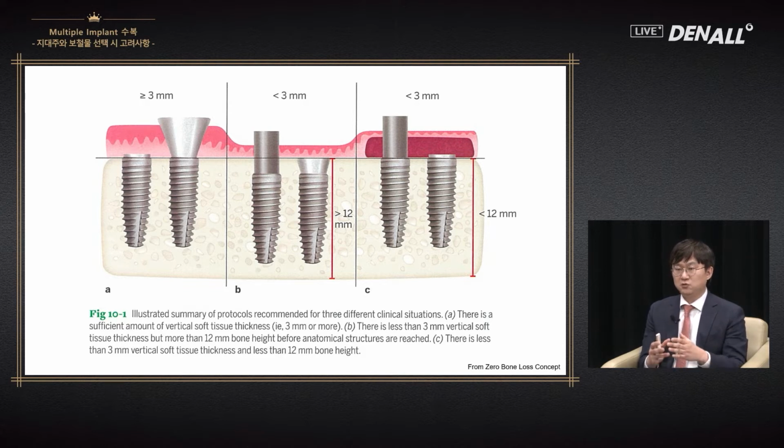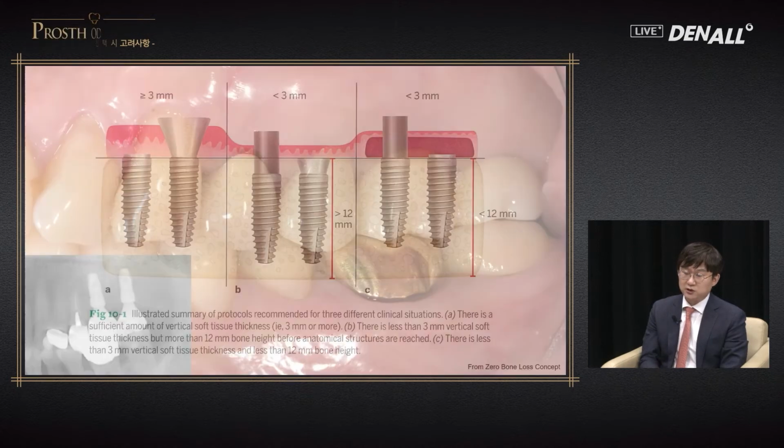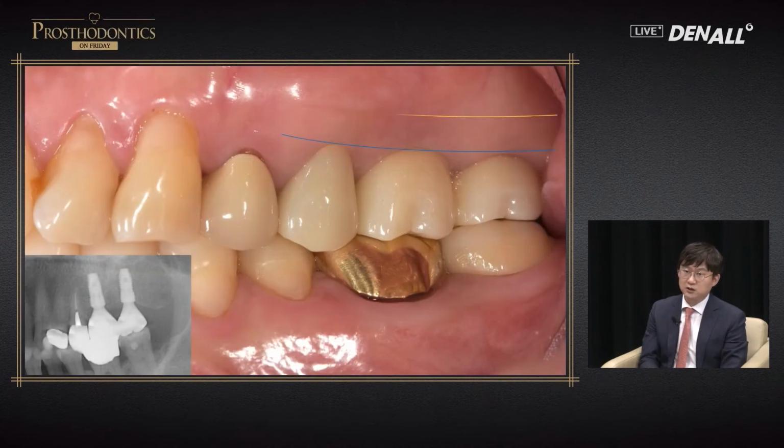We need to consider gingiva recession when the gingiva profile is created. The depth to the implant connection from the crest of bone should be deeper.